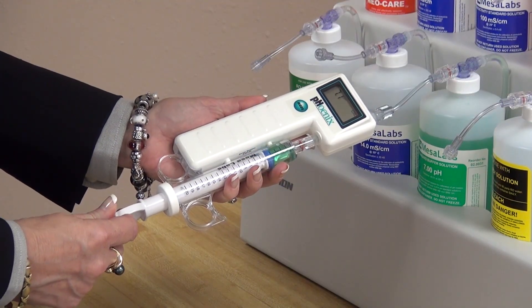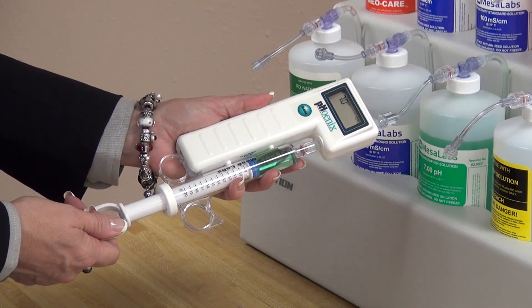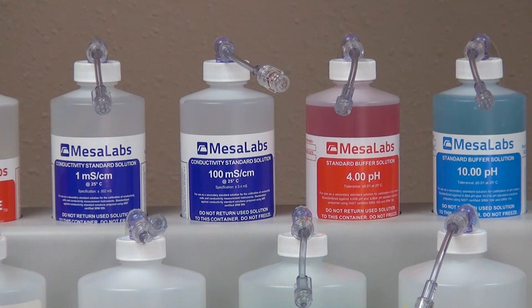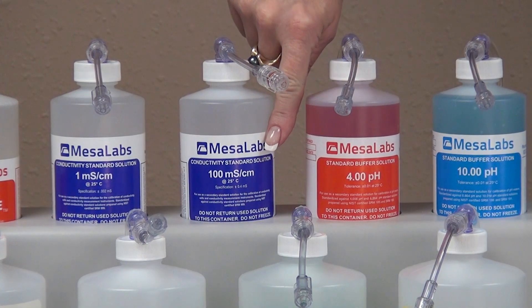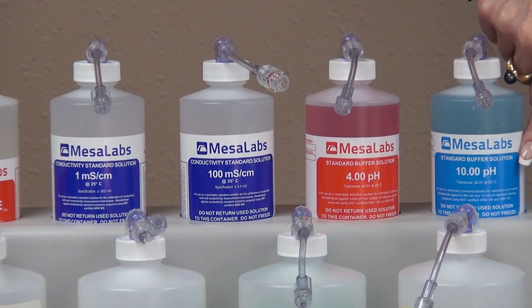Expel and discard the solution. Draw a fresh solution to confirm the accuracy of the displayed reading, which is 7.0 pH. To perform the Level 2 calibration, do not exit Level 1. Additional materials needed for the Level 2 calibration include the NIST traceable sodium chloride 1 millisiemen conductivity solution, the 100 millisiemen conductivity solution, the 4.0 pH buffer solution, and the 10.0 pH buffer solution.